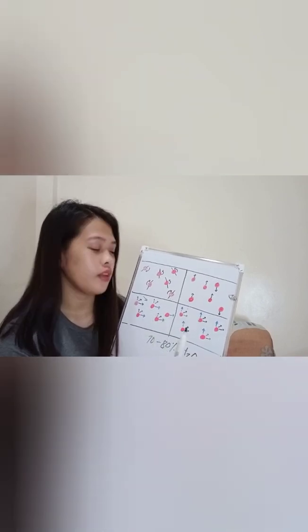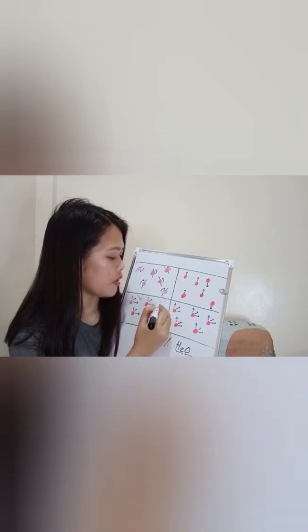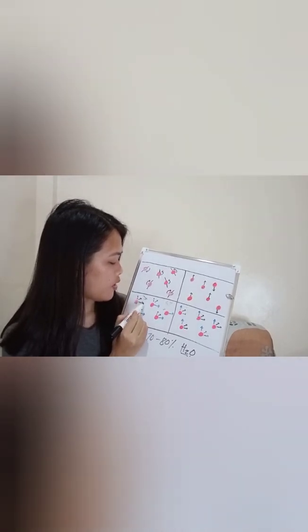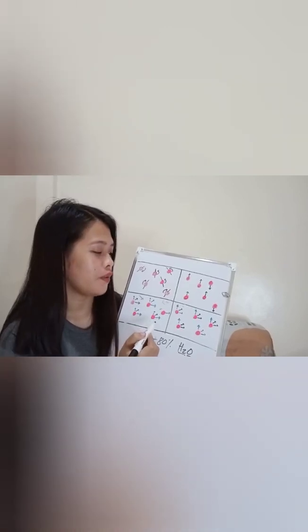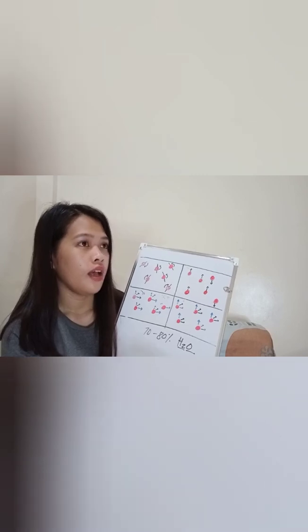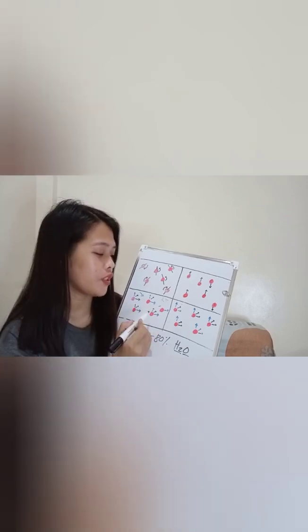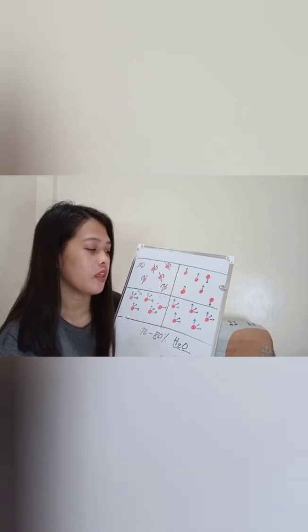When the RF coil transmits an RF pulse, it results in a disturbance of proton alignment. Some low energy parallel protons flip to a high energy state, decreasing the longitudinal magnetization. Also, protons become synchronized and precess in phase. As a result, the net magnetization turns toward the transverse plane, at a right angle to the primary magnetic field.